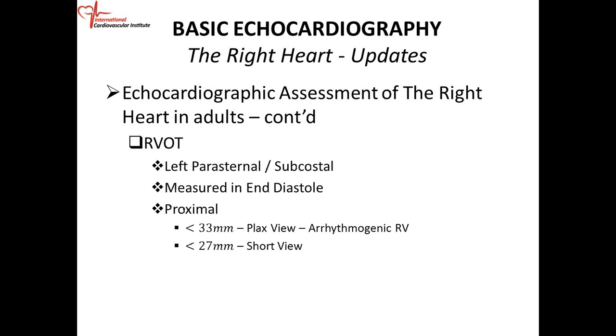All right, we did a little bit of this as well. The right ventricular flow tract. So these are all measurements to determine the size of the right ventricle. So we use the right ventricular flow tract.